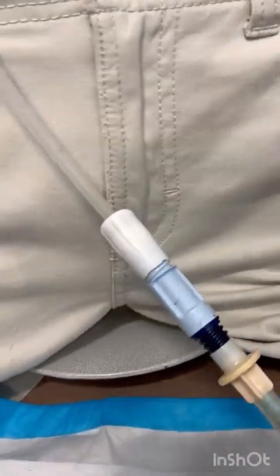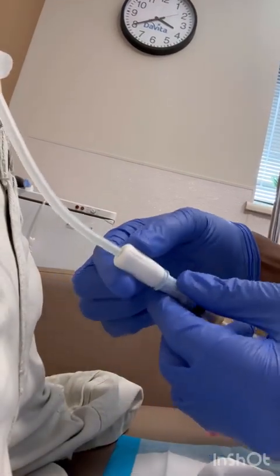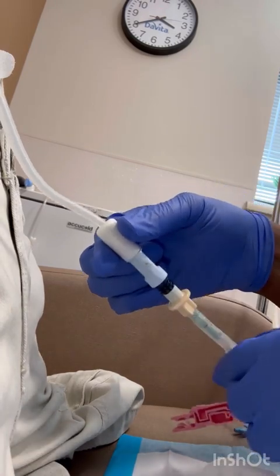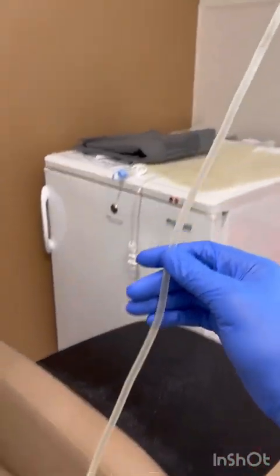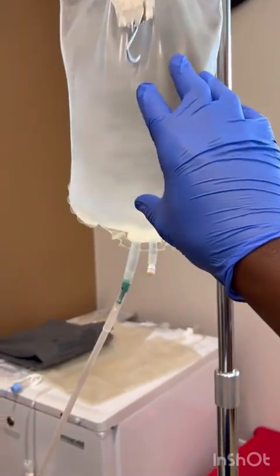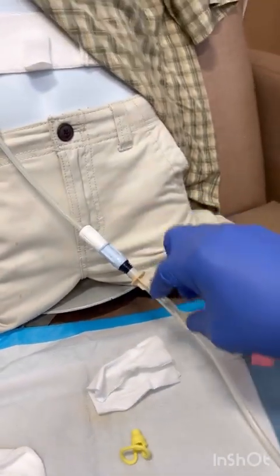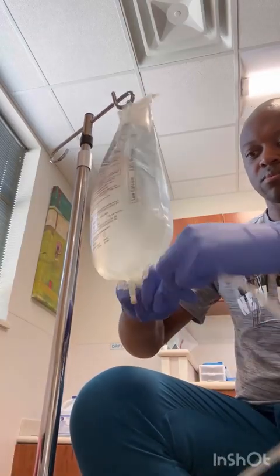Now that we're done draining, close that transfer set. Now we're going to flush the line — that fill line is filled with air. We don't want the air to go inside of you because Steve will have a lot of shoulder pain for like five days. We're going to push that fluid out and it's going to bypass this closed transfer set and go into that drain line. Break the frangible back and forth around the world.